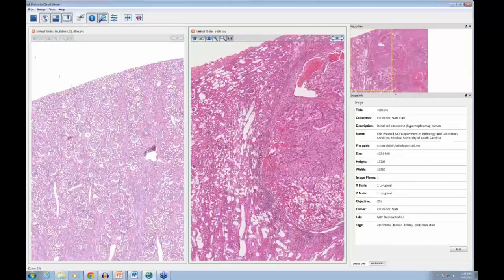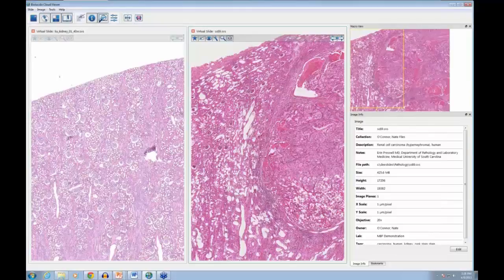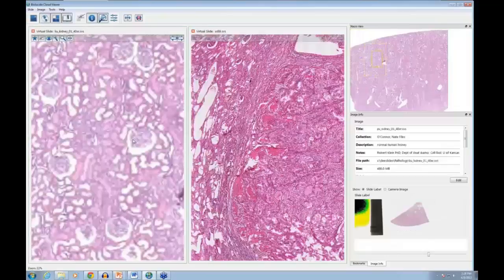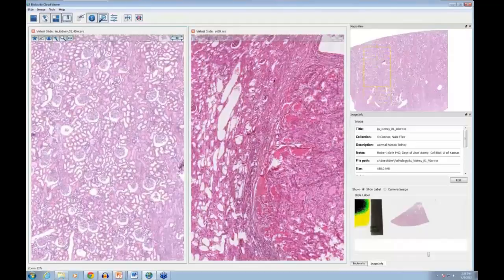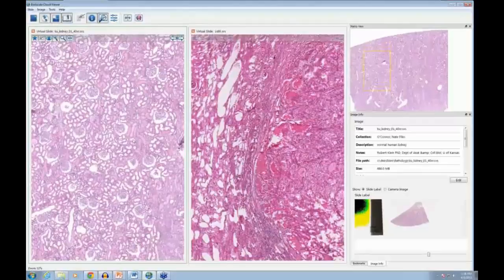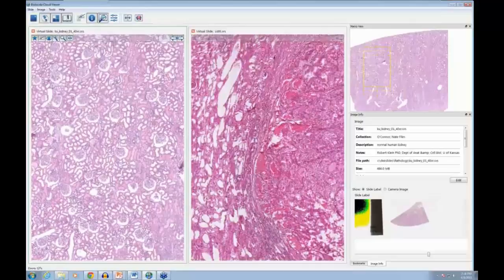With the two images at the same zoom level, I can synchronize them so that zooming or panning one will do the same to the other. This is useful for comparing histology to pathology, for viewing adjacent serial sections with different preparations, or for similar preparations. We're pushing quite large image data simultaneously over a network, which is pretty impressive.